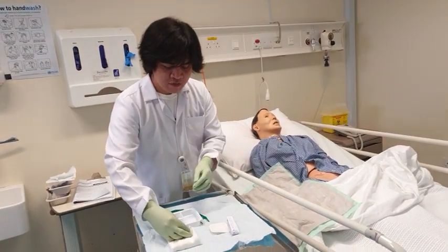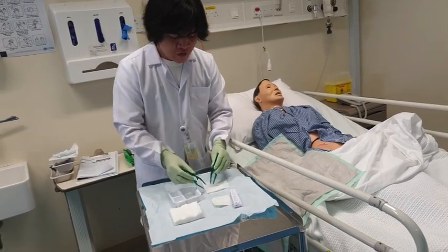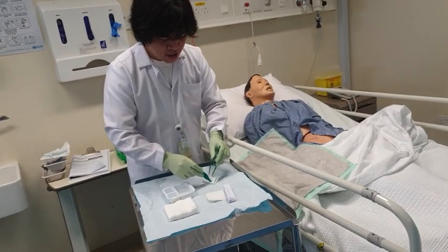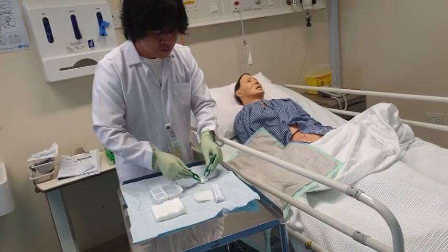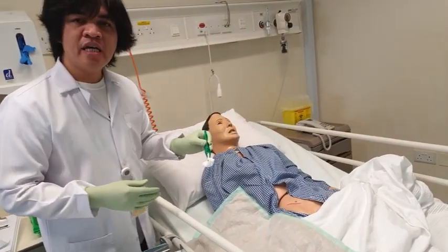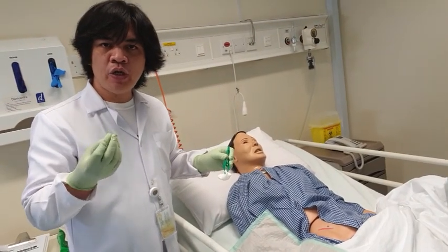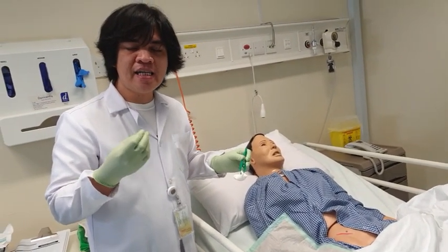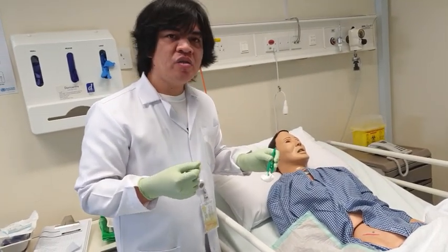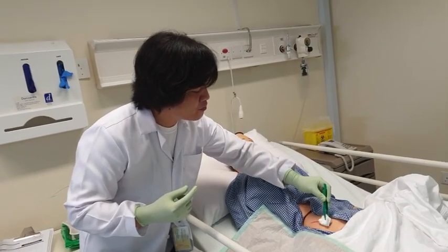We have a gauze here. And we need to fold this gauze like sambusa. Okay? And then start drying the wound. In drying the wound, you do not dry the center of the wound. Why? Because the moisture of the disinfectant, the cleaning agent, will promote wound healing. So instead, we're just going to dry the side. In one direction also. Okay?